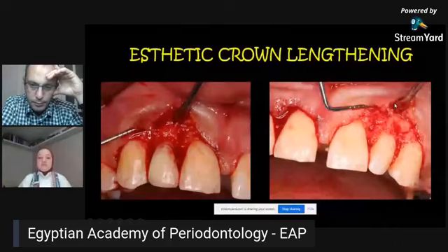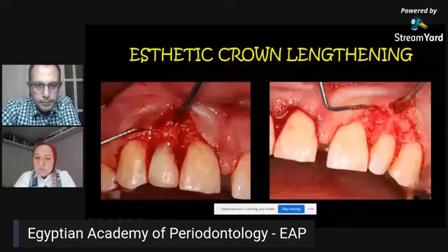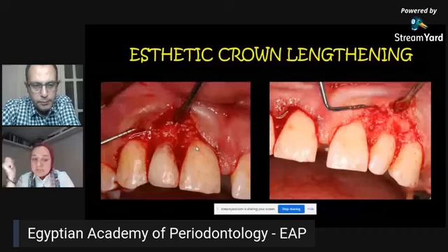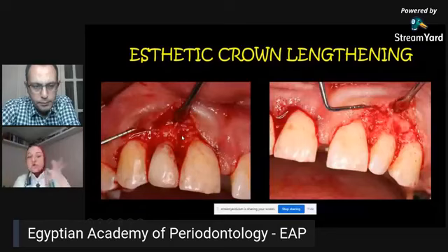And as you can see here, we have a clear violation of the biological width because the crown margin is so close to the bone. You can see this is almost 1 millimeter, and usually we need about 2.5 millimeters between the crown margin and the crest of the bone, or any final restoration you are placing, in order to preserve the biological width, the epithelium and the connective tissue, or what we call in the new classification, the supracrestal soft tissue. You can also notice that you have an open margin. Actually, the crown is not really adapted on the finish line, and both of these facts cause the continuous inflammation with this crown.